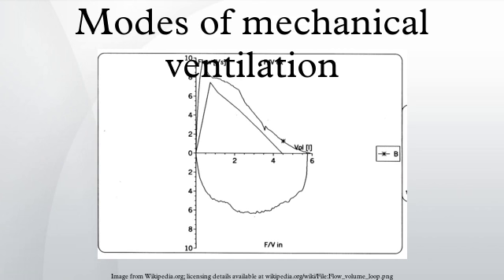is achieved. The method for monitoring whether or not the patient is meeting the required minute ventilation differs by ventilator brand and model, but, in general, there is a window of monitored time, and a smaller window checked against the larger window to decide whether a mechanical breath is needed to maintain the minute ventilation. MMV is an optimal mode for weaning in neonatal and pediatric populations and has been shown to reduce long-term complications related to mechanical ventilation.